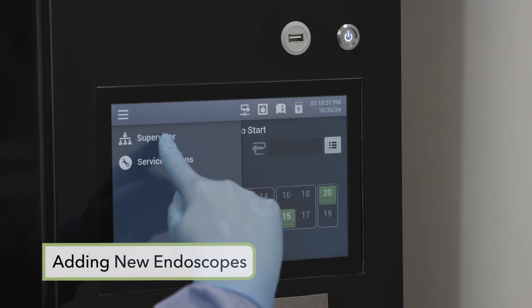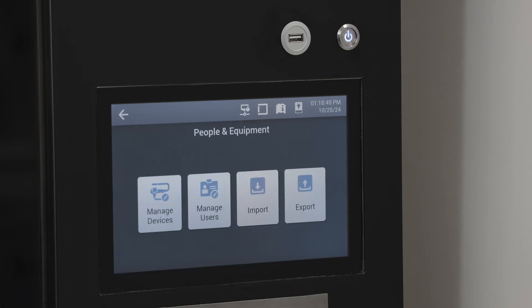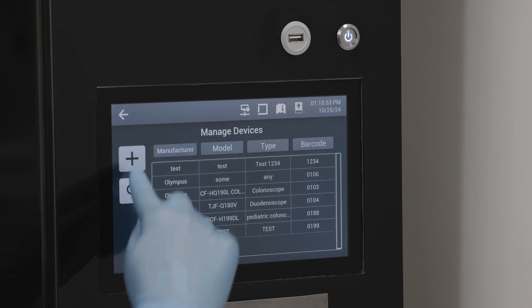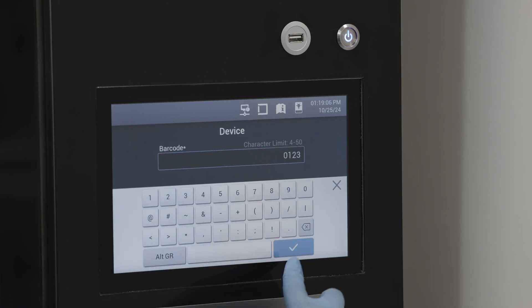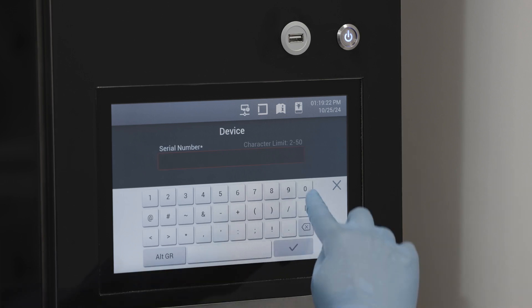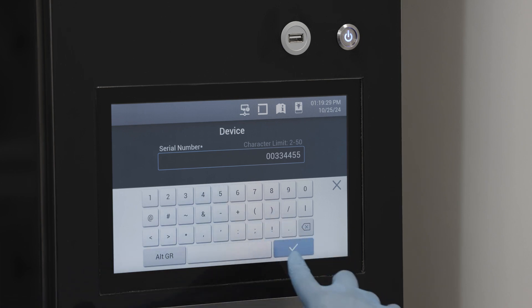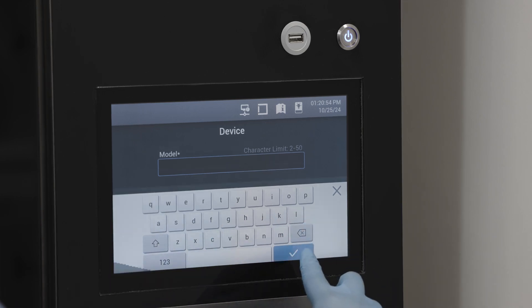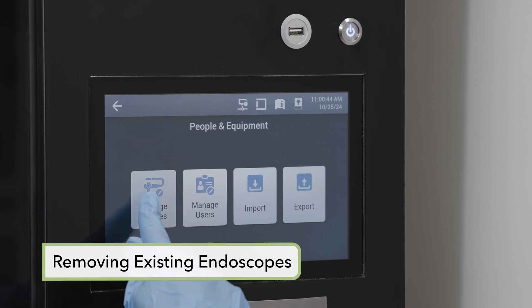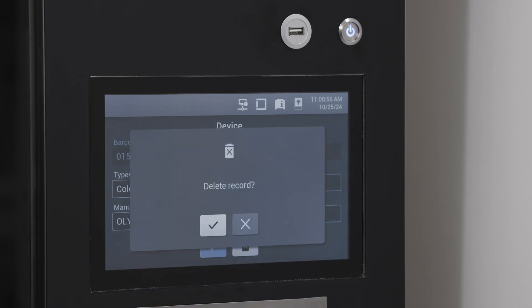To add new endoscopes to the cabinet, enter supervisor mode as previously described. Select people and equipment, then the manage devices screen, and tap the ID barcode field. Enter the endoscope details using the barcode scanner or manually via the virtual keyboard. Tap the manufacturer serial number field and type in the scope serial number using the keyboard. Once complete, select OK to submit the changes. Select the model number field, enter the data using the keyboard, and tap OK to confirm. To remove endoscopes, enter the manage devices screen, select the endoscope to be removed, select delete, confirm the action in the dialog box, and select OK.